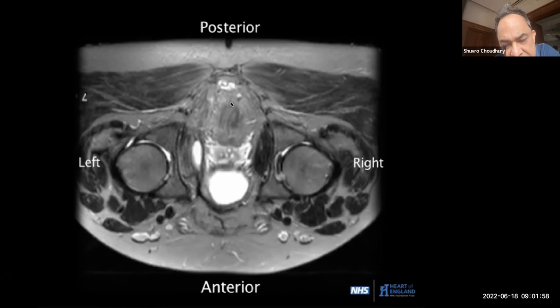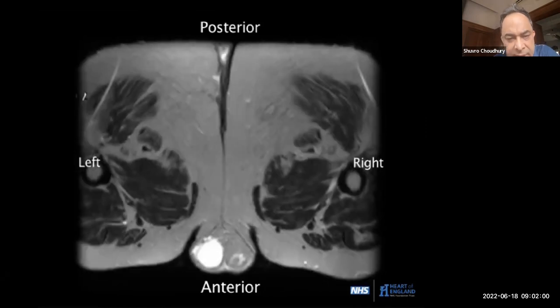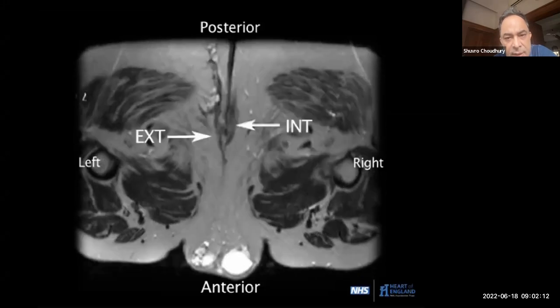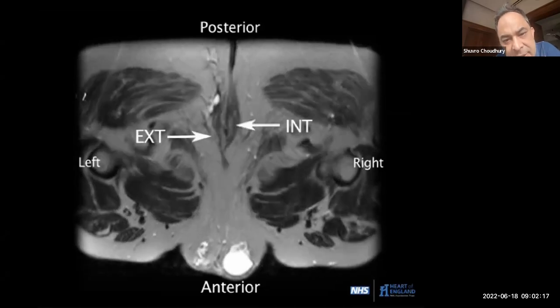The anal canal picture is not so clear here. So, okay, this might be better. So we are coming from below upwards, I think. Okay, scrotum. This is the anoscrotal raphe. Now on this picture, Dr. Banerjee, this little gray is the internal sphincter just coming. The external sphincter is the blacker one. Always the external sphincter is darker, the internal sphincter is grayer.